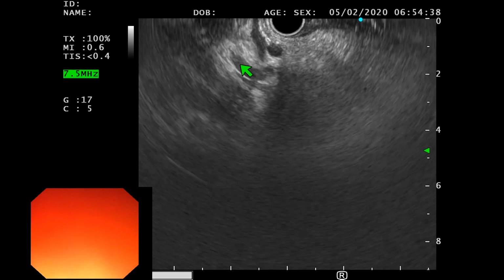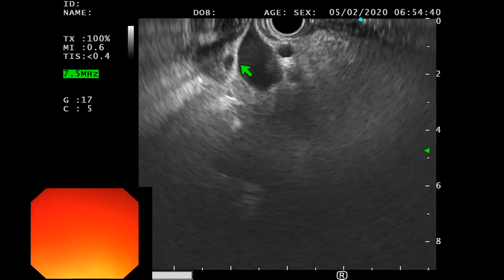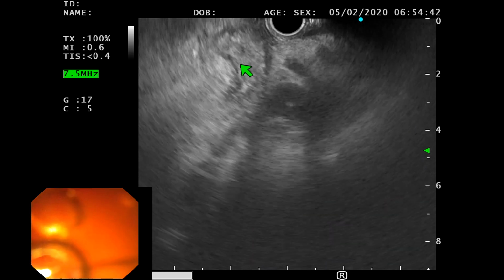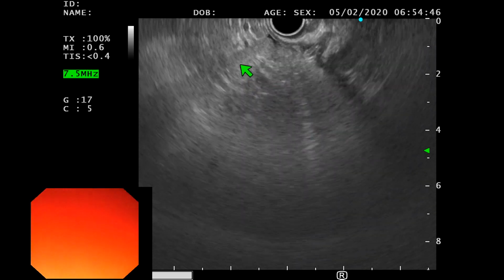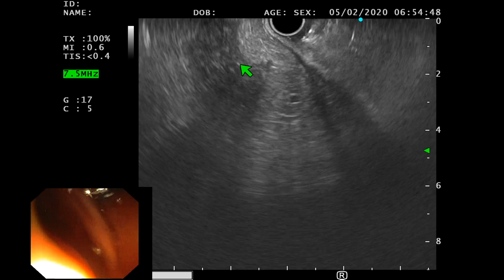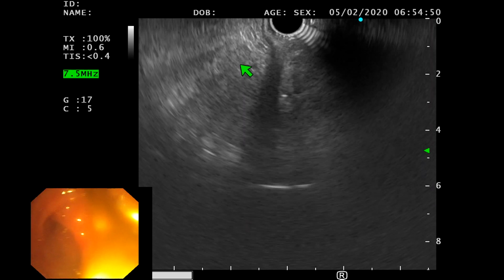We also saw stent. We're lost, right? So the thing to do is, just see. Doctor, I'll have to take over. One second. I need to see what this is.